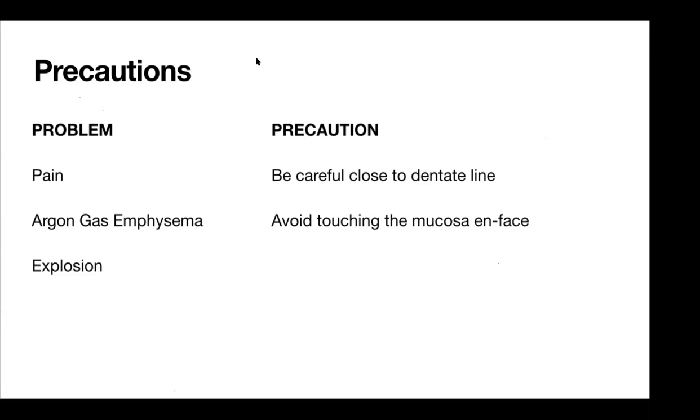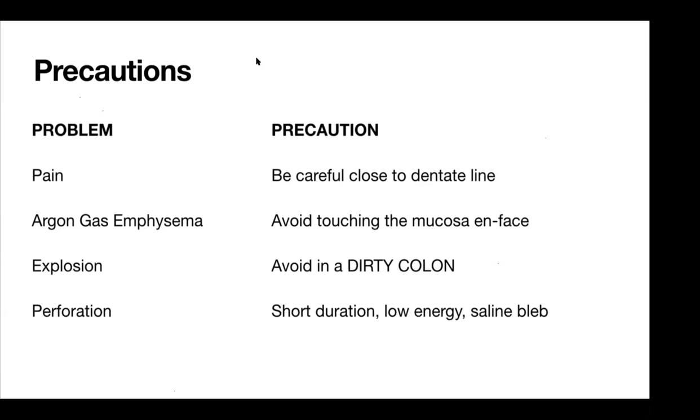And we talked about colon explosion, and then perforation. You avoid perforation by using a short duration of application and low energy to start with, and then get into the habit of creating a saline bleb.